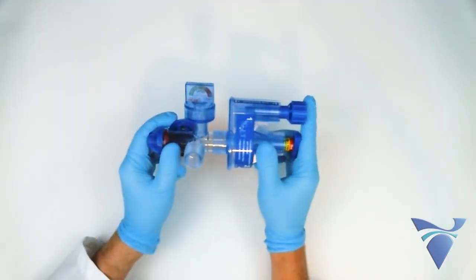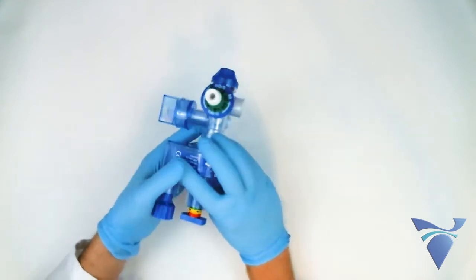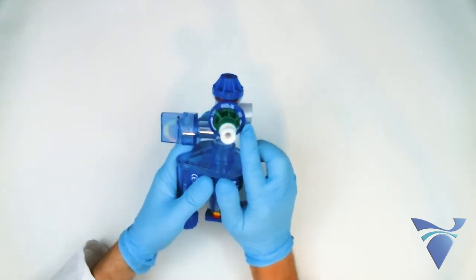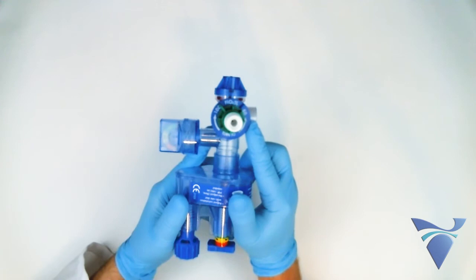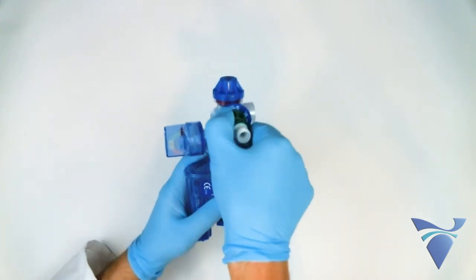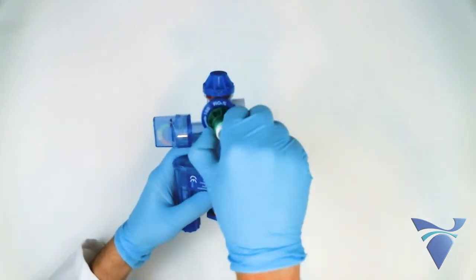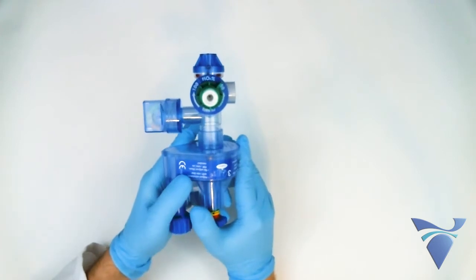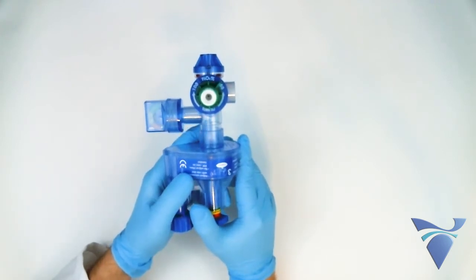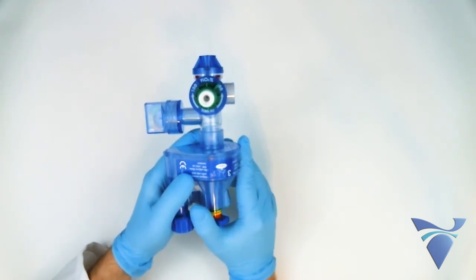Also included is a feature to adjust the patient's FiO2 from 100% to 50%. Simply rotate the entrainment knob to the 50% setting. This will entrain ambient air to combine with the oxygen, allowing you to decrease your flow meter by roughly one-third of its original setting to deliver the same amount of flow to your patient.